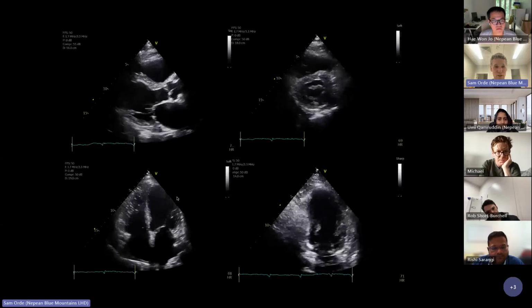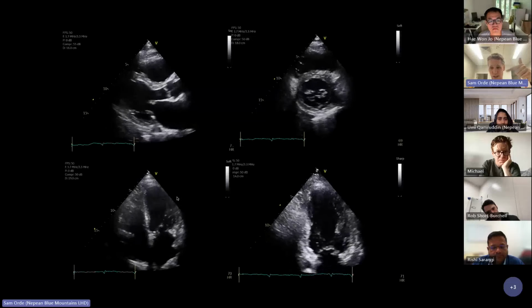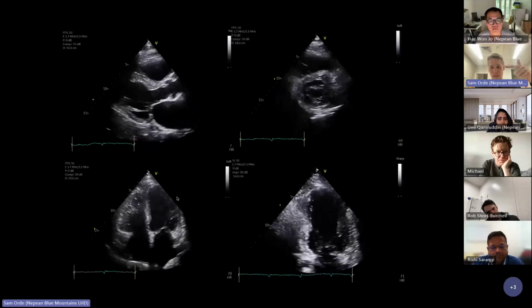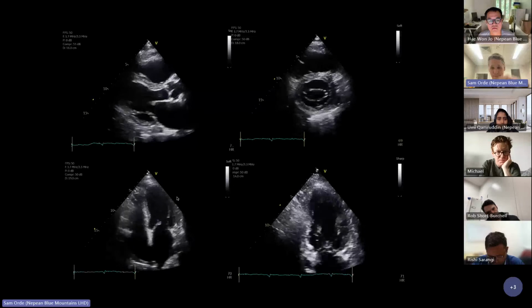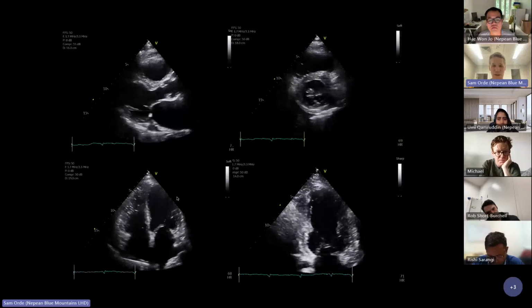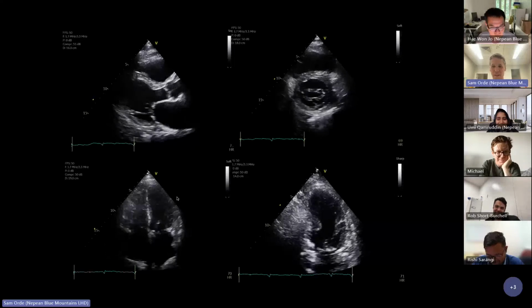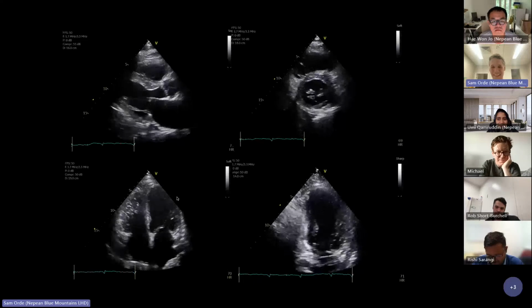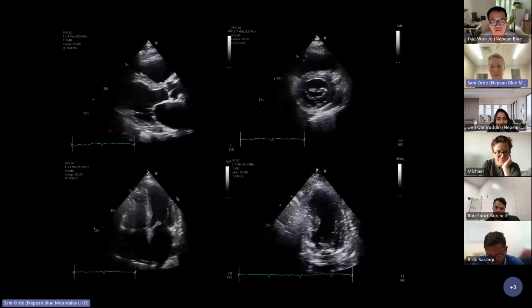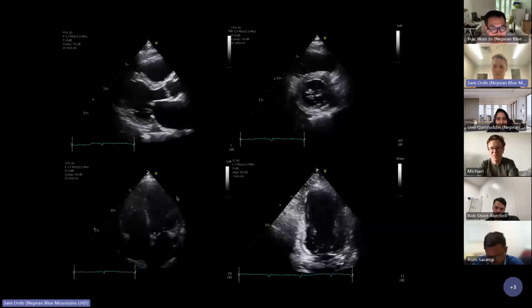And that systolic function is normal or hyperdynamic, so if the ejection fraction is over 70, 75%, it's mild, it's moderate, or it's severe. It is never mild to moderate. It is never reasonable. It is never lower end of normal. It is never severe to moderate. Now it may be on the balance somewhere, and that's where we've got to use our clinical judgment.